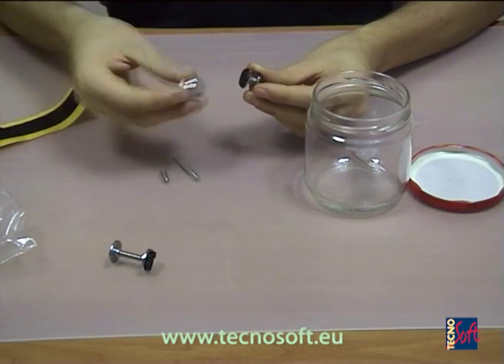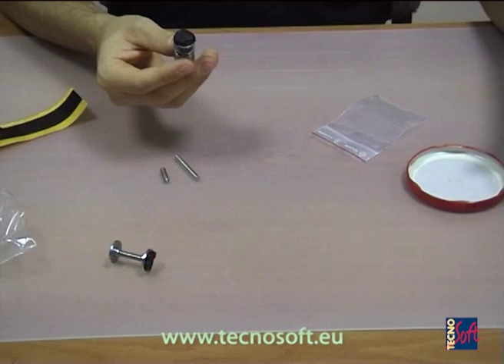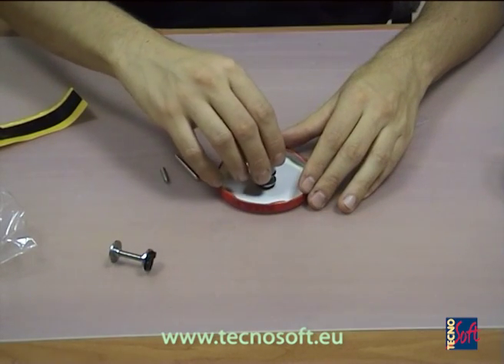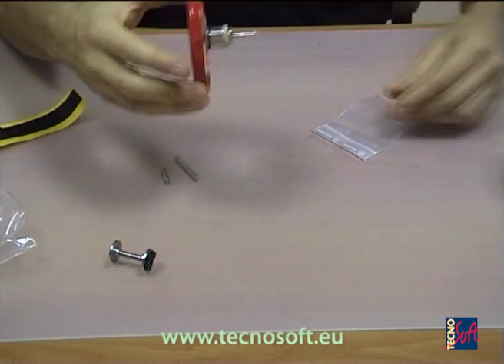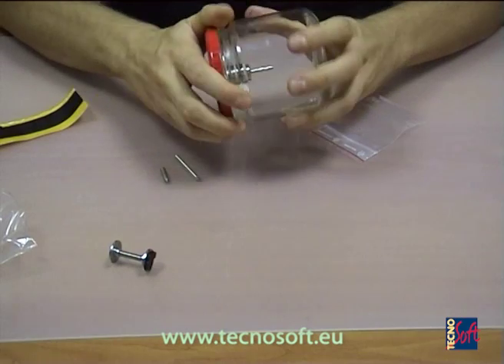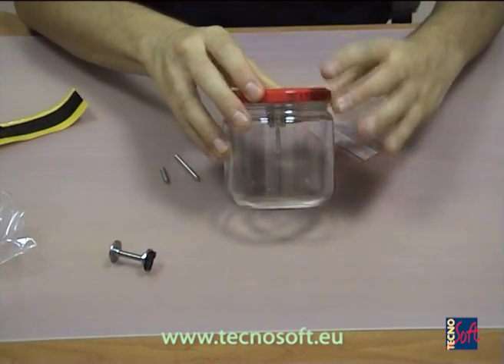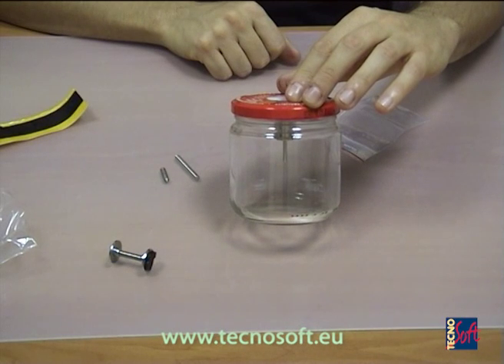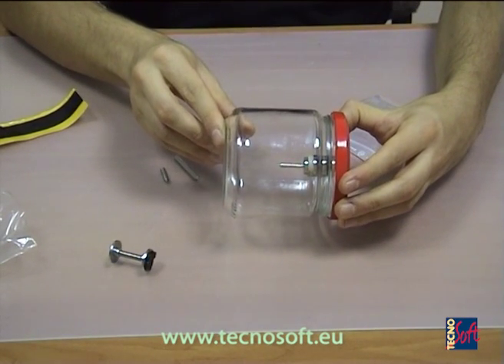We place the logger on one base — be sure to press it tight — and the other base we press on the cap. Of course you can use the base inside the jar, but on the cap it is much easier. And here it is: the tip of the probe is at the center of the jar.